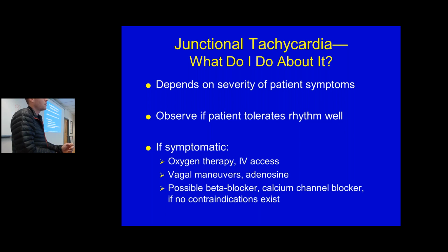I mean, when you look at just the junctional versus a re-entry, where they both can have inverted P waves, is there something about a re-entry rhythm or the way that it presents? It's going to be obvious, but you're like, no, this is a junctional.